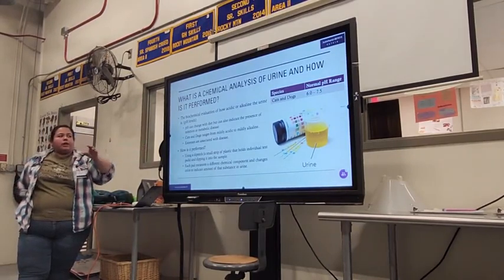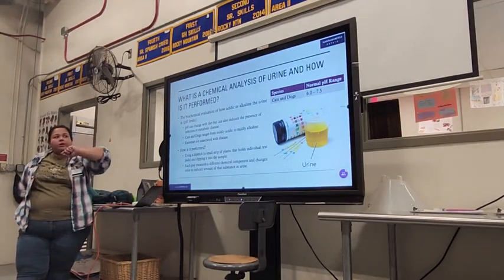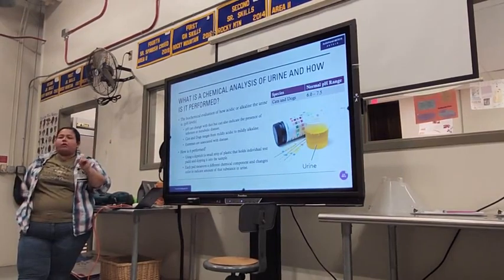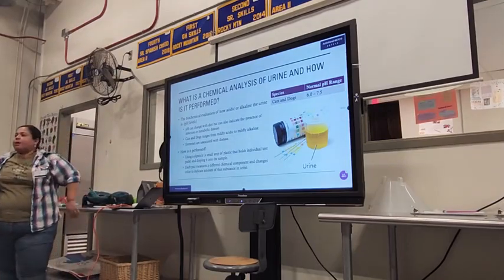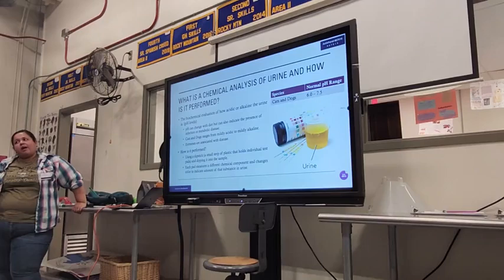Cats and dogs range from mildly acidic to mildly alkaline. And I'm pretty sure you're like, well, what the heck is that? Do we have a number value? Yes, we do. Numerical value. Normal pH range should be anywhere from 6.0 to 7.5 for dogs and cats, okay? It's very important to remember. Any extremes below 6 or above 7.5 is abnormal and needs to be further tested, okay?